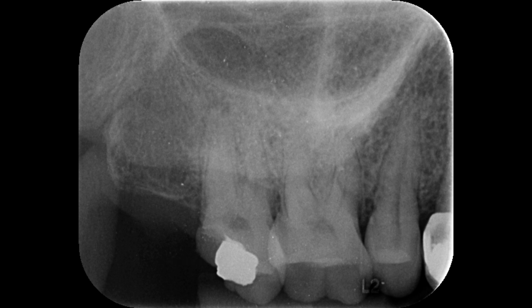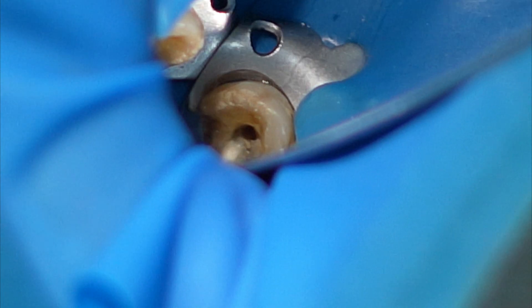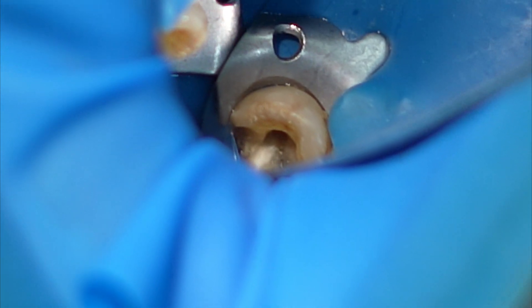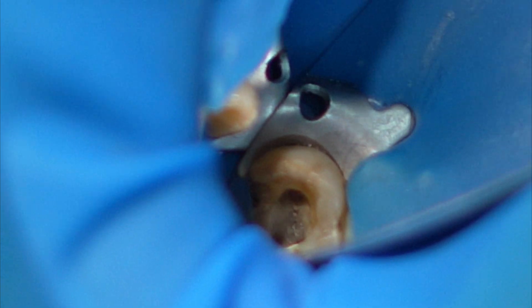After that I removed this faulty restoration from the tooth. I located all three canals and prepared them to taper. Let's see all three canals — this is the palatal canal, and these are the two buccal canals: the meso-buccal canal and the disto-buccal canal.